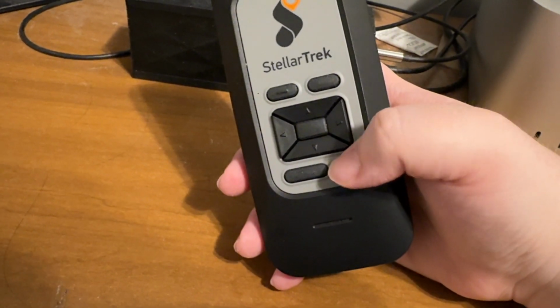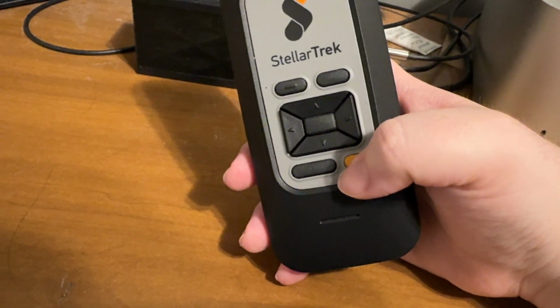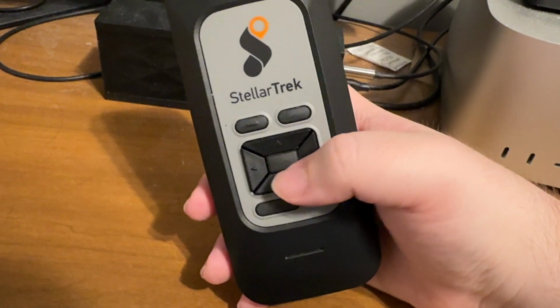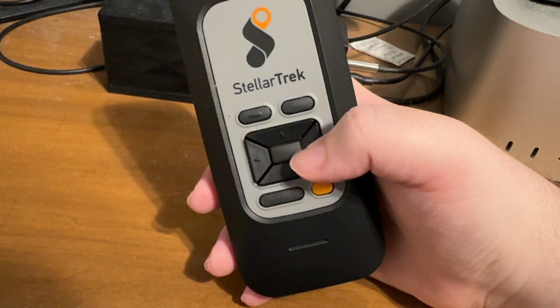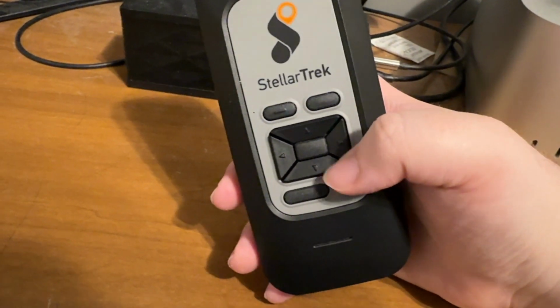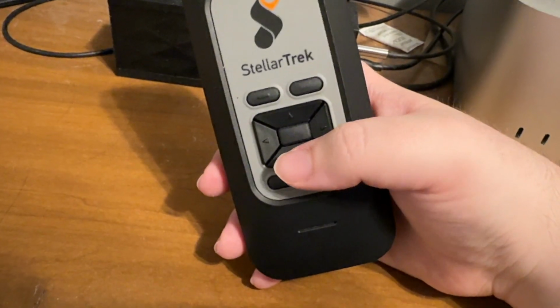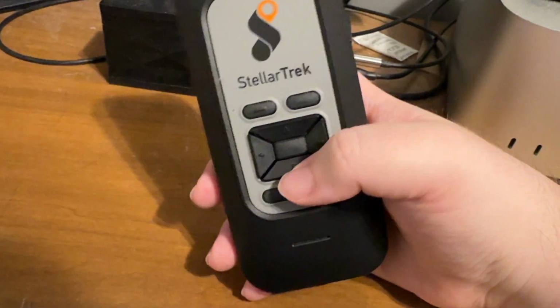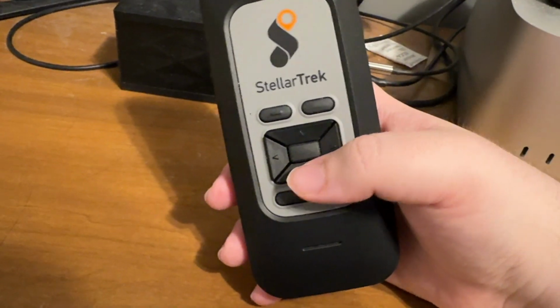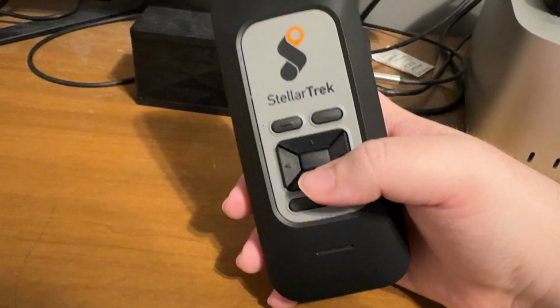But overall, it's a very straightforward process, as you saw, to enter an address on the StellarTrek. And once it's there, it gets saved as a landmark, so you don't have to worry about it again. It's going to be right there for you to use when you are ready to navigate to that destination again. And if you do want to remove it, that is very straightforward as well.